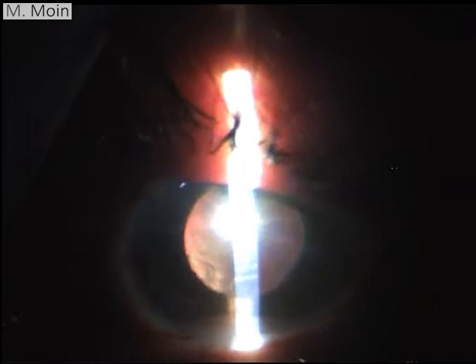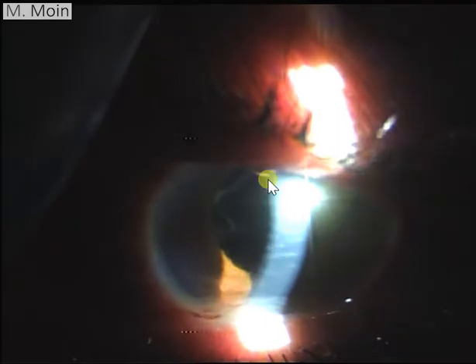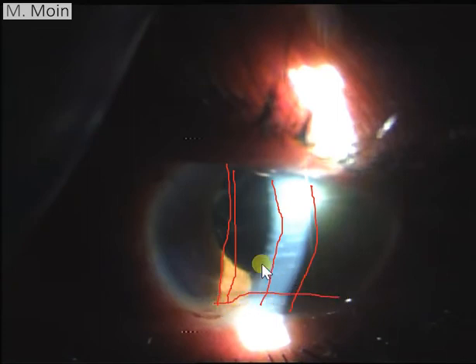Welcome to this video in which we'll be showing you an anterior segment case, and here you see the area on the cornea. If I show you, this is the broad anterior segment slit, this is the anterior part of the slit, this is the posterior part of the slit you're seeing over here. If you look carefully in the anterior chamber, you will see a whitish level over here. Then these are horizontal lines over here which are representing Descemet's membrane folds. There are sutures over here, and then there's ciliary congestion over here.